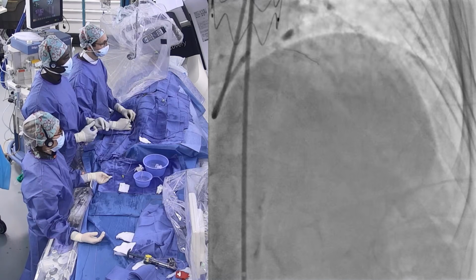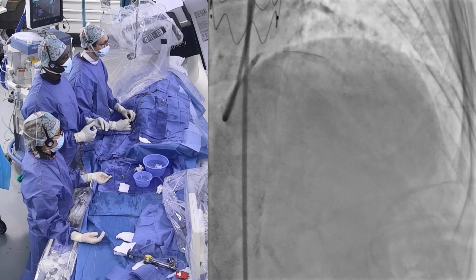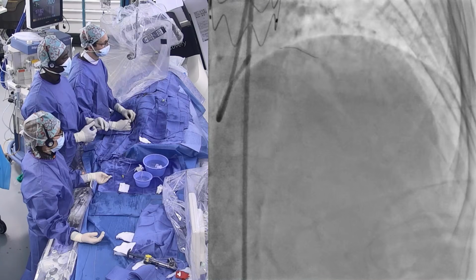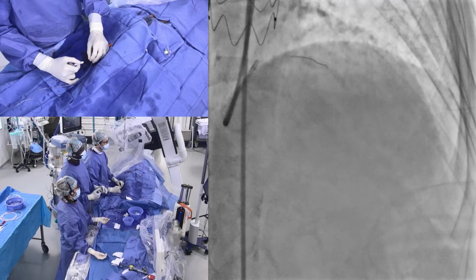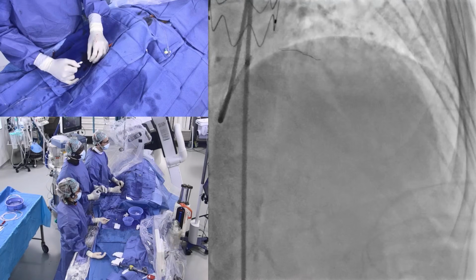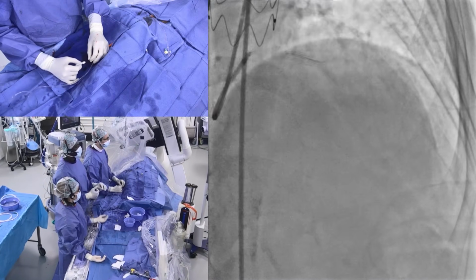Well, if I can spare a microcatheter, I would always try to do so. It all depends on how tortuous and long the lesion is. I must say, we can anticipate that it's going to be a difficult lesion because it's long, it's tight, as Flavio was saying. There are several branches, which is typical of LAD lesions. So I'm very curious to see this premiere, we can say, of the new RotaWire, how it will perform.